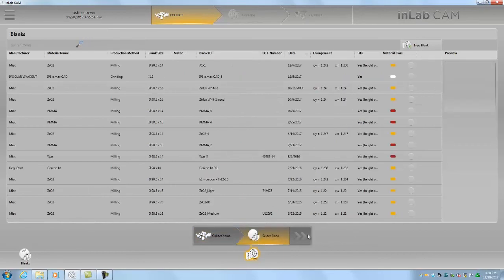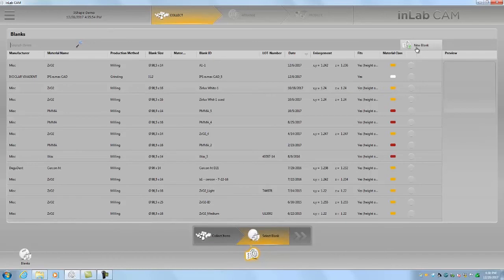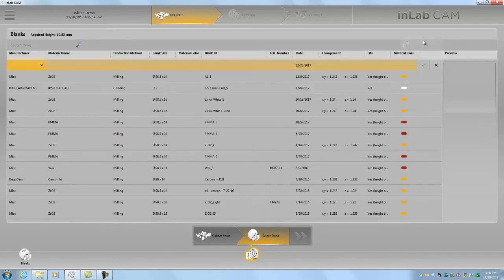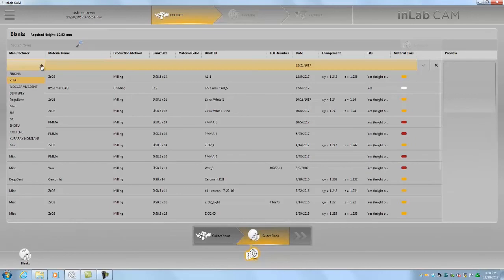Okay so again here we're going to choose a new blank since the Emacs blocks are single use, at least for the one that I'm doing. So we'll choose Ivoclar.